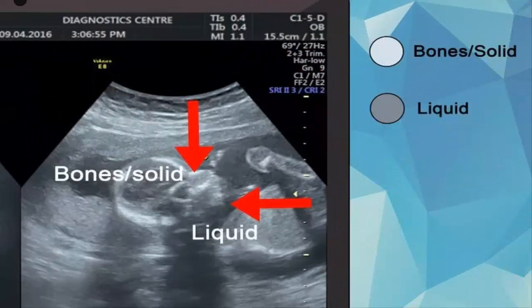3. Consider the differences in colors. Most ultrasound images are in black and white, but you can see differences in the shades of black and white in your ultrasound scan. The color differences come from the differences in the densities of the materials that the sound passes through. Solid tissues, like bone, will appear white because the outer surface reflects more sound. Tissues that are filled with liquid, like the uterus, will appear dark. Ultrasound imaging does not work well for gas, so organs that are filled with air, like the lungs, are generally not examined with ultrasound.